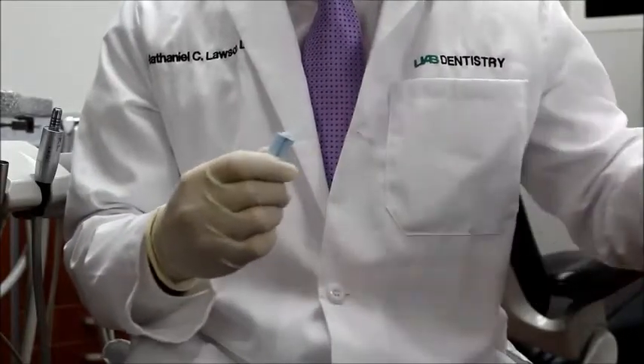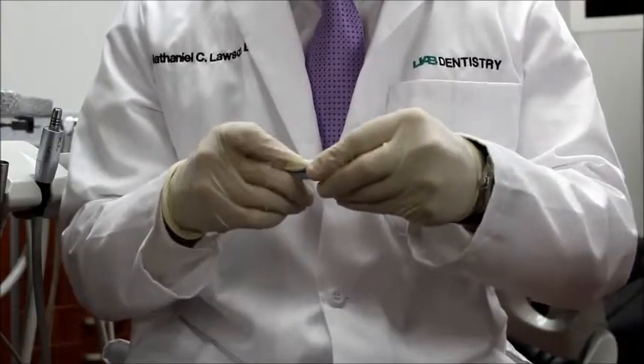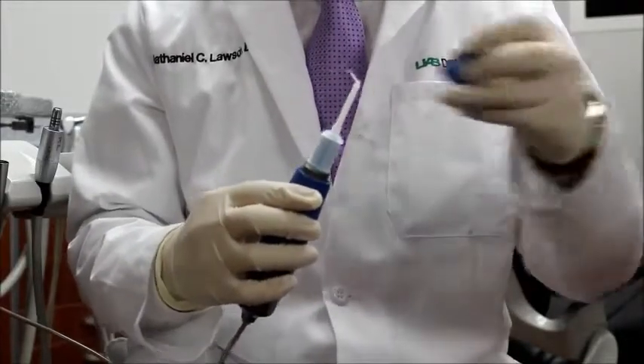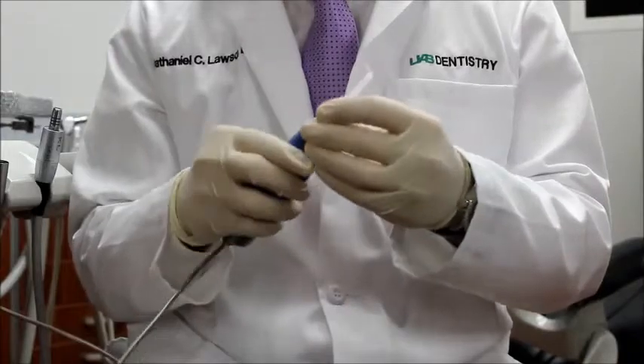The unit is set up by removing the cap off of the cartridge, then placing the cartridge into the tip. The cartridge and the tip are then placed into the handpiece, and the cap is securely applied to the top of the handpiece. The unit is now ready to go.